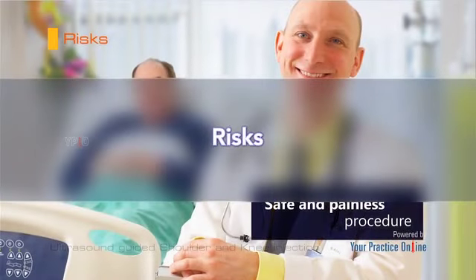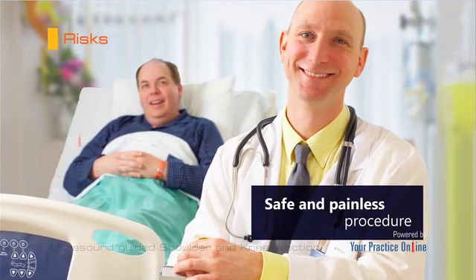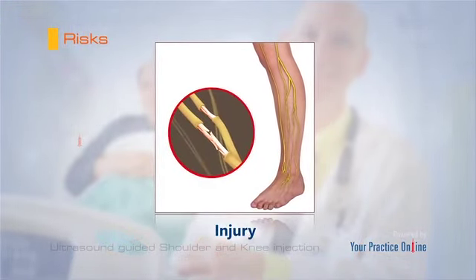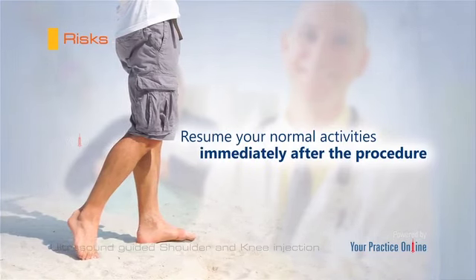Risks. Ultrasound-guided injection is a relatively safe and painless procedure. Some of the associated complications include bleeding at the site of insertion and injury to adjacent structures. Patients can resume their normal activities immediately after the completion of the procedure.